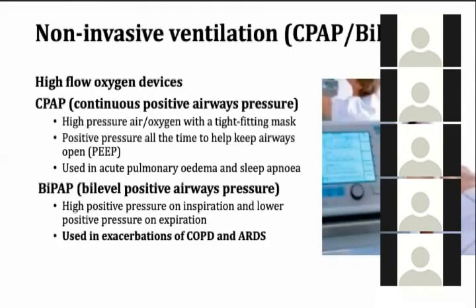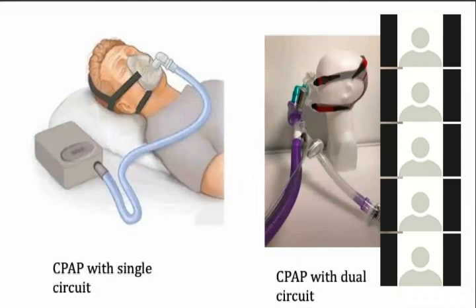And this is called a non-invasive type of ventilation. When you have ventilation lectures, you will see this. There are different types of non-invasive ventilation. I just wanted to show you all the machines that we use, and they can be used with some other respiratory supports as well. You can not only increase the oxygenation, you can support the ventilation as well. You can support the patient's breathing, in other words. So these are the devices that you see.